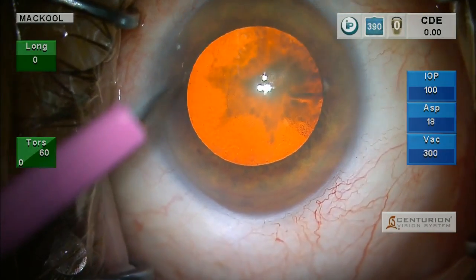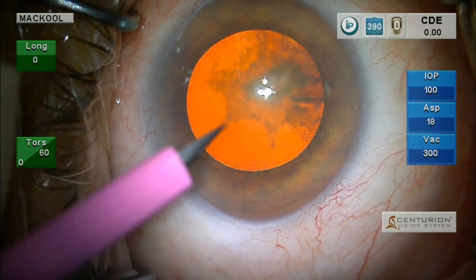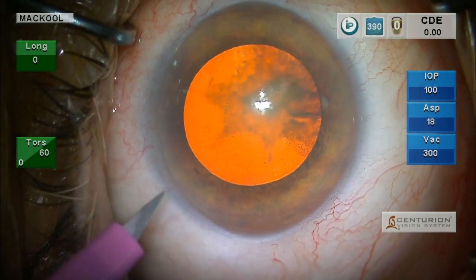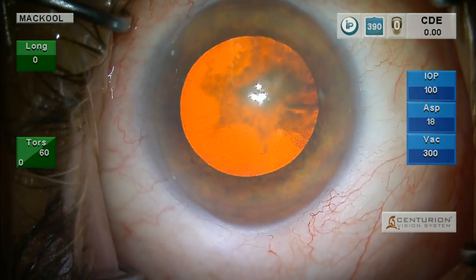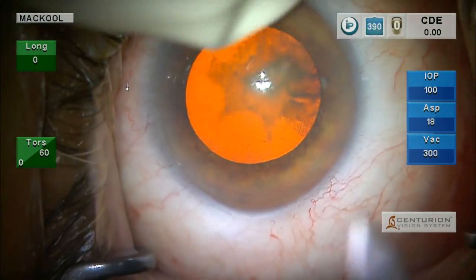This patient has pseudoexfoliation. Although she dilates fairly well for pseudoex, you can see the little linear opacity on the anterior surface of the crystalline lens — the cataract — and has a big obvious posterior subcapsular lens opacity.